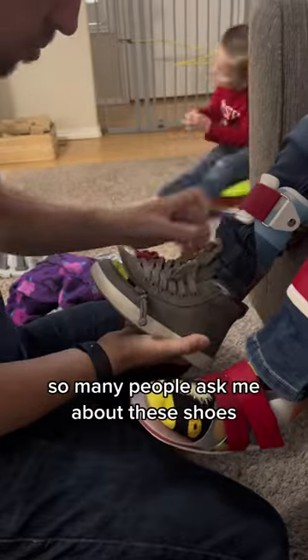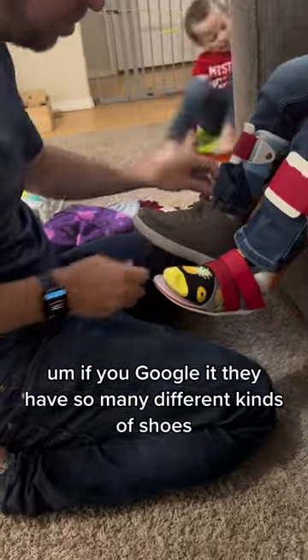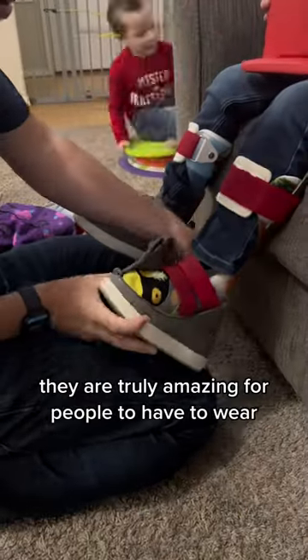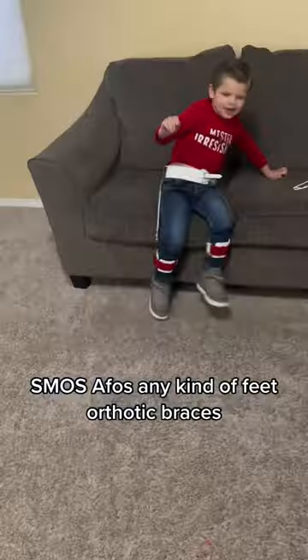Now we have to put his Billys on. So many people ask me about these shoes. You can go to Billy's if you Google it — they have so many different kinds of shoes. They are truly amazing for people who have to wear SMOs, AFOs, or any kind of feet orthotic braces.